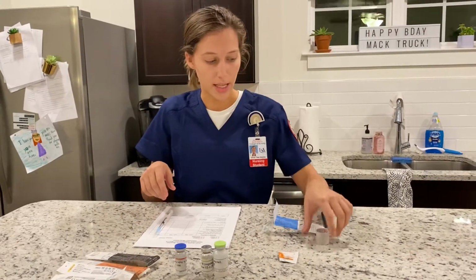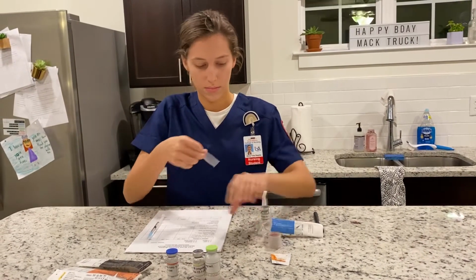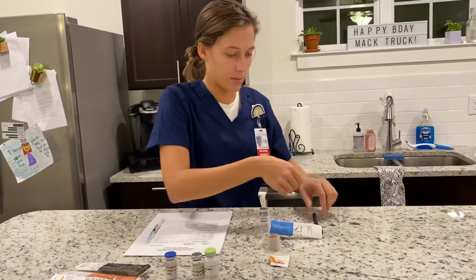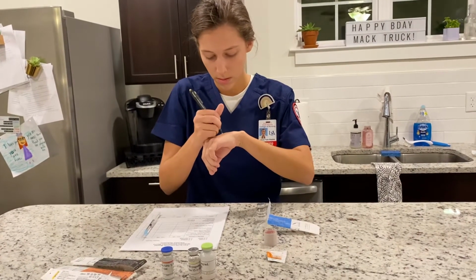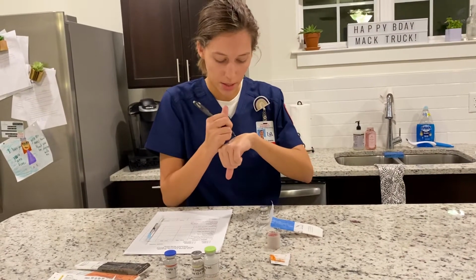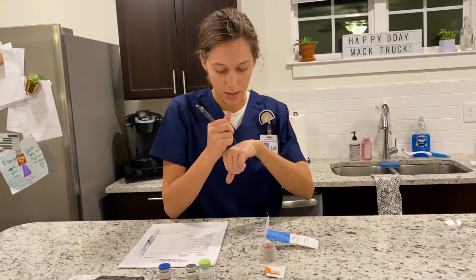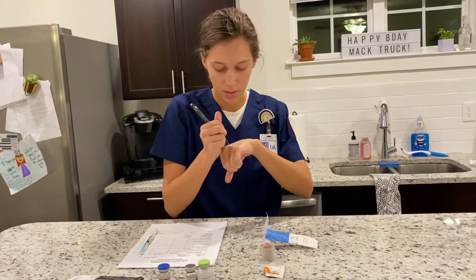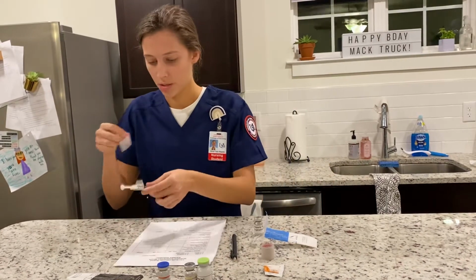And now I'm going to create a label. And on this label, I'm going to write the patient's name, Jaguar Jones. I'm going to write his drug, heparin, and the amount, 0.5 milliliters. And then I'm also going to initial it. I'm going to put this on the syringe.